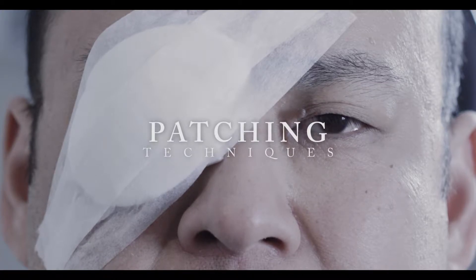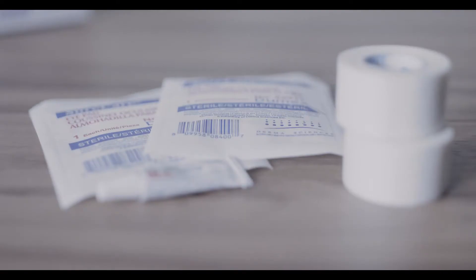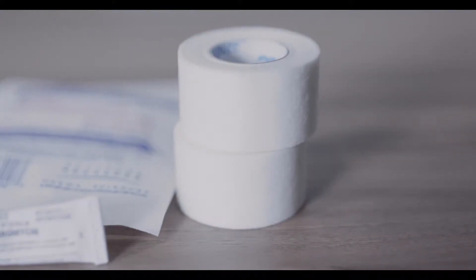Shield patching is often used when your patient has an eye injury or trauma. Knowing how to properly apply a patch is a useful skill to have. The materials required for ocular patching are tape, two eye pads or gauze, and ointment.